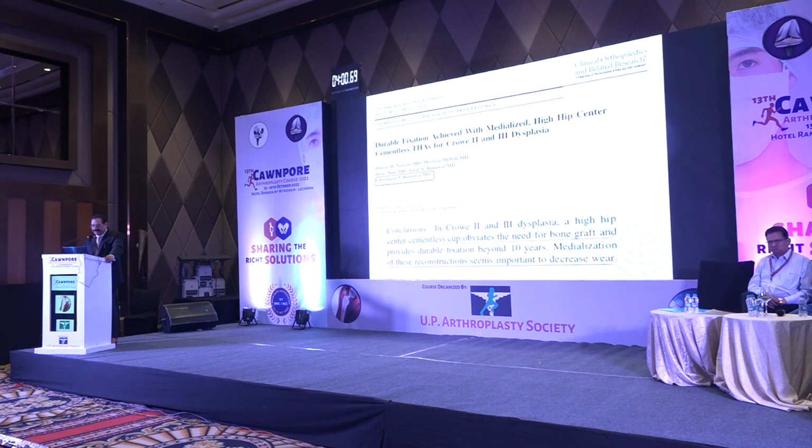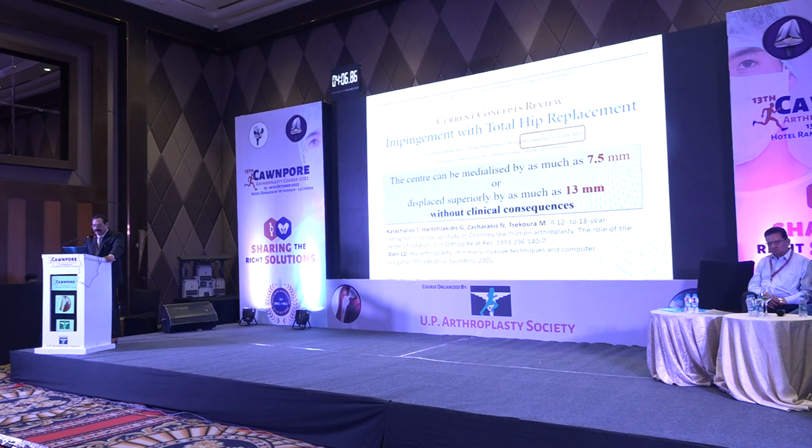Same sentiment, same recommendation by Professor Ranawat, and similar recommendation by Larry Dorr in current concept reviews. He says the center can be medialized by as much as 7.5 millimeter, or it can be displaced by as much as 13, few authors have mentioned 15 millimeter superiorly without clinical consequences.